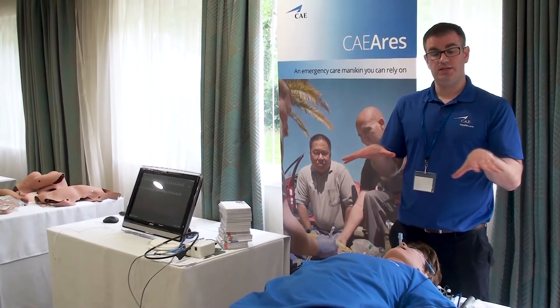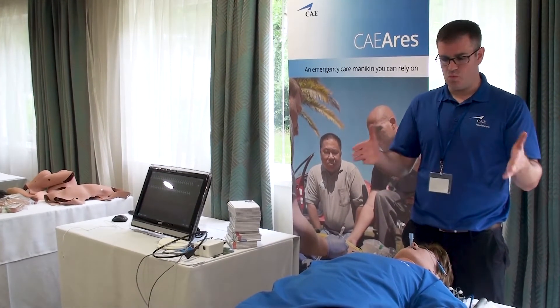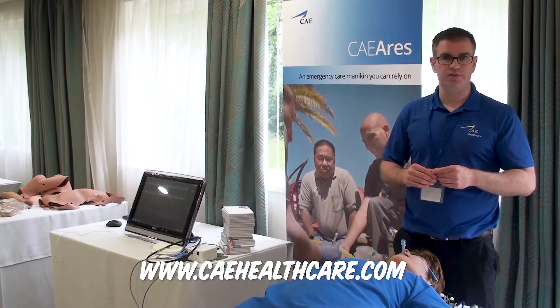In summary, CAE ARIES is a mid-range simulator, very well priced. We feel hospitals, universities, and emergency services will find great use for this simulator. If you need to know more, just Google CAE ARIES and you'll find videos online covering pretty much what I've demonstrated here.